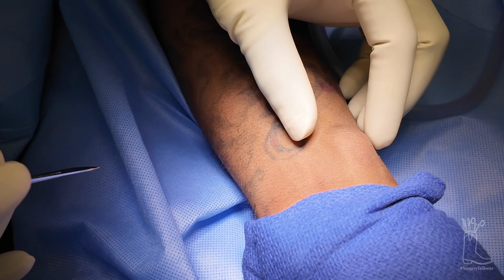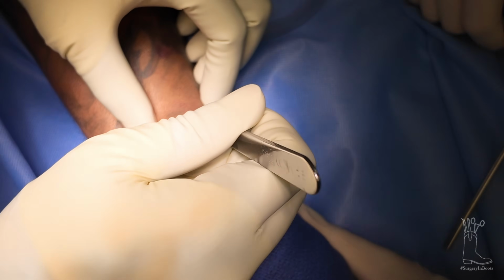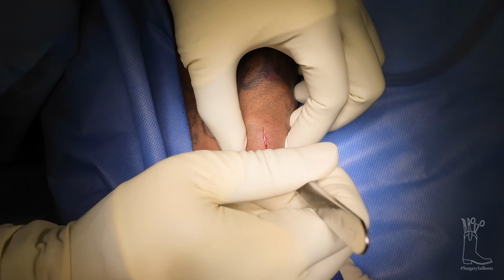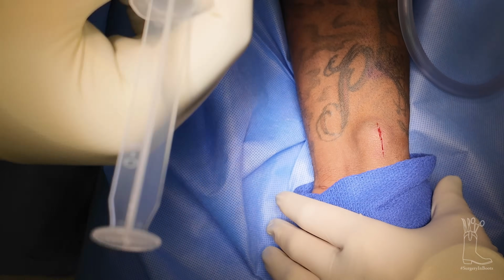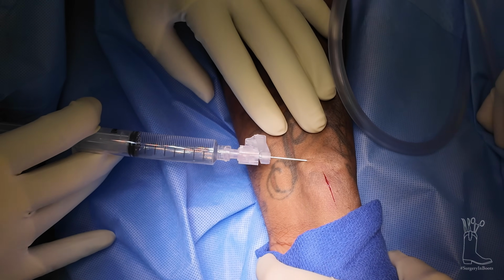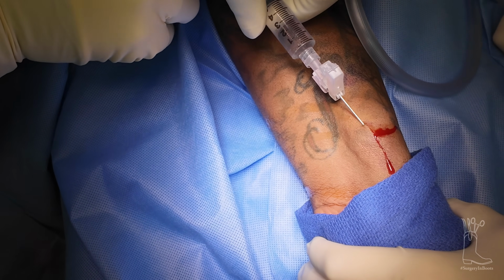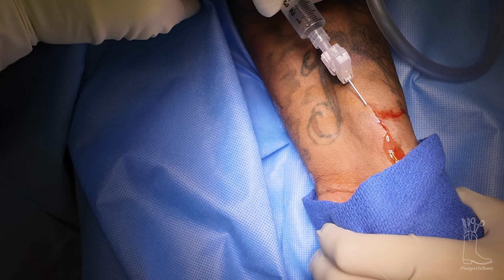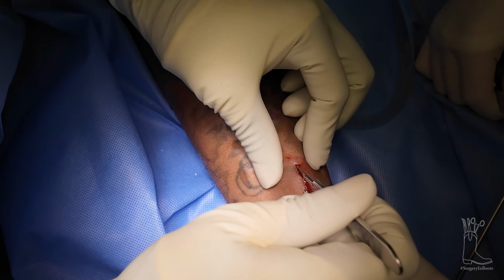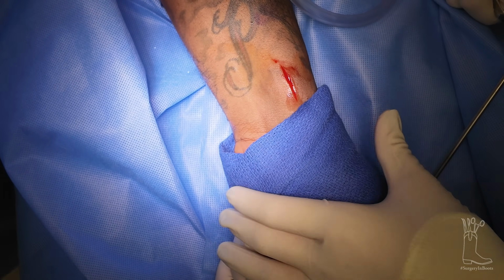So this is it. So we're just gonna make an incision right on the top of it. If we go too deep, of course. Let's see. So we can lower this. Try not to do this on these aneurysms sometimes because you'll poke the aneurysm. Because we're trying to get all the lidocaine in. So there, so we can go across.